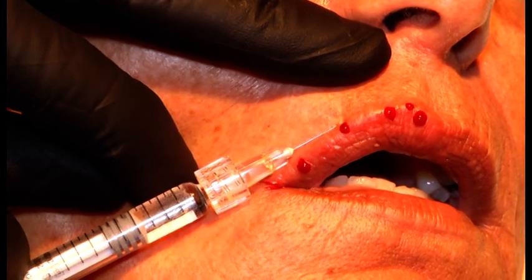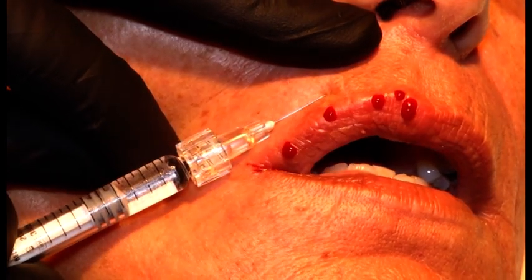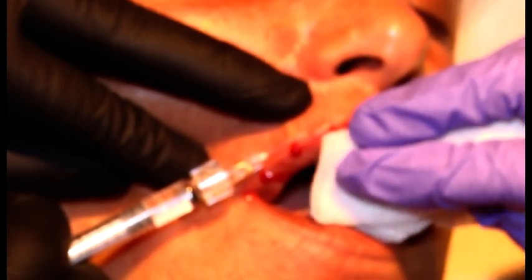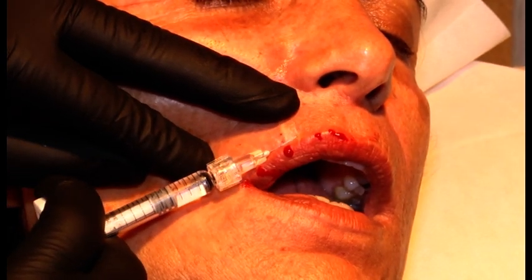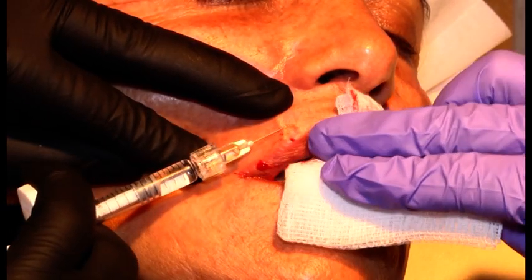1. You see that I place my needle very superficially. I start to inject, and there's a little bit of white halo. This is Belotero Lips Contour. It's actually very similar to Belotero Balance.